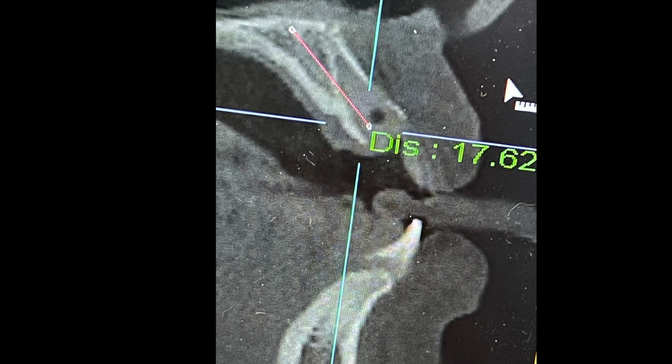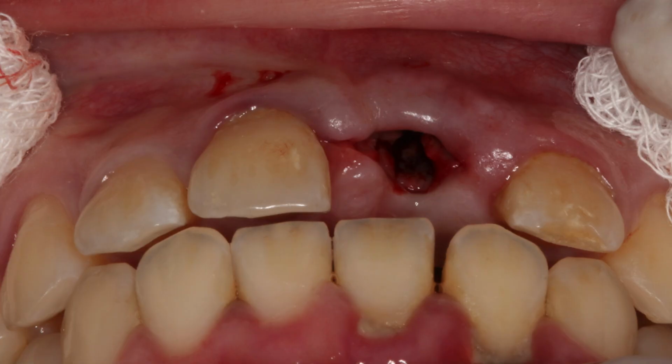Initially, when CBCT was relatively new, we basically got into the habit of doing this. For more information on this, I have another video online on taking the proper CBCT. For the sake of time, I would like you to refer to that. But this is just not realistic.